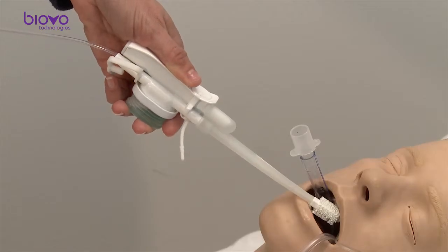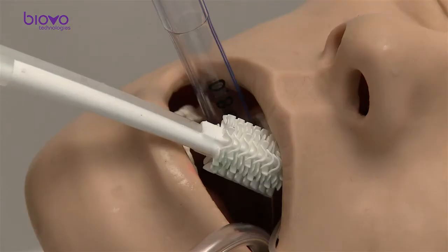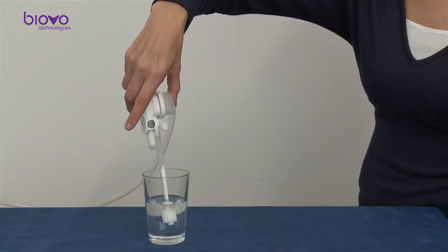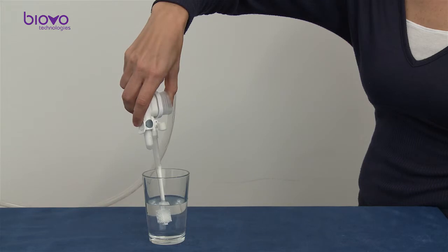To eject fluids, press gently with your thumb. Suction is controlled with your finger. When done brushing, rinse to clear the suction line.